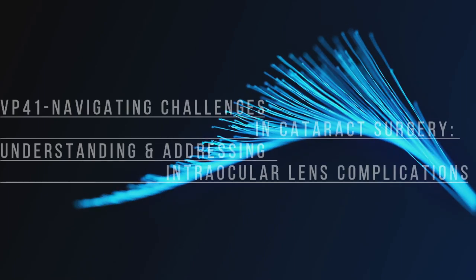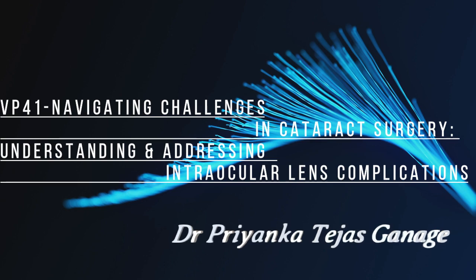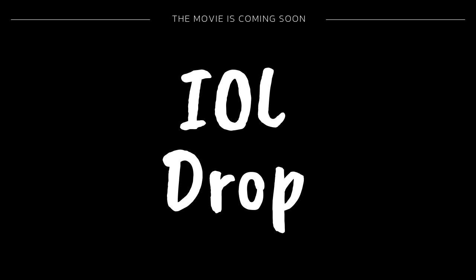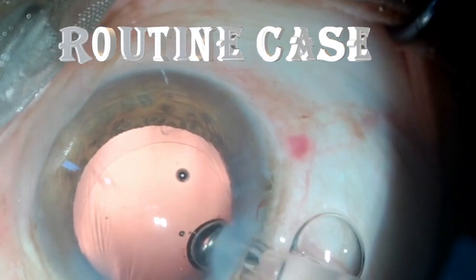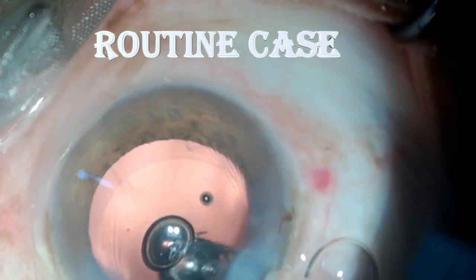This video presentation is about navigating challenges in cataract surgery, understanding and addressing intraocular lens complications. In this video, we will go through 3 case scenarios. It is said that the case is not over until it's actually over.